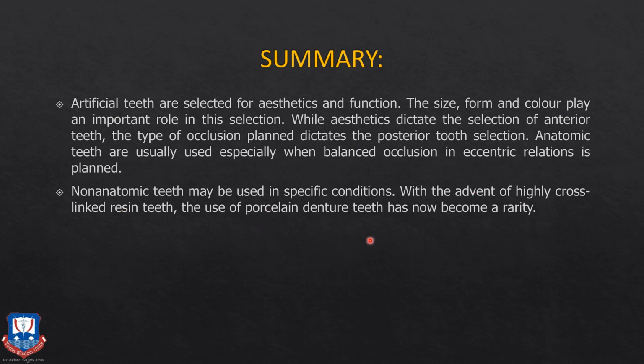With the advent of highly cross-linked resin teeth, the use of porcelain dental teeth has now become a rarity. So we never see porcelain teeth being used nowadays. Most of the time we are just using acrylic teeth, high impact resin acrylic teeth, or IPN, that is, interpenetrating polymer network teeth.